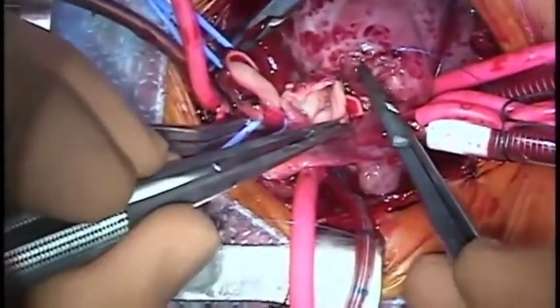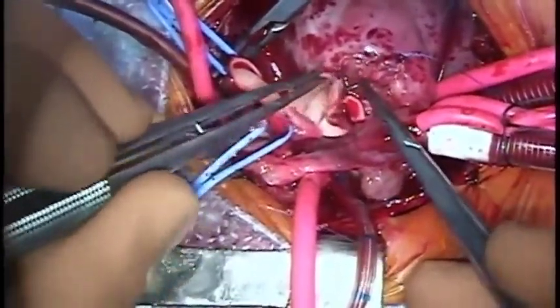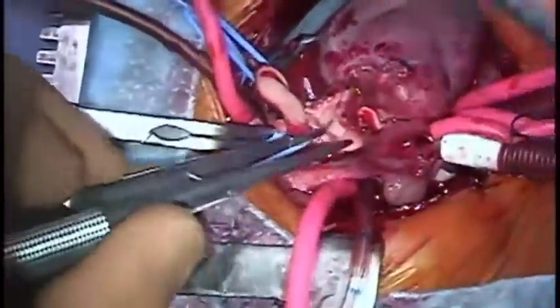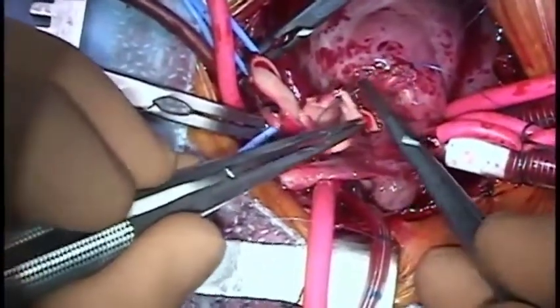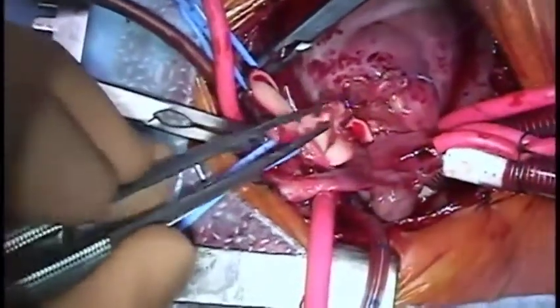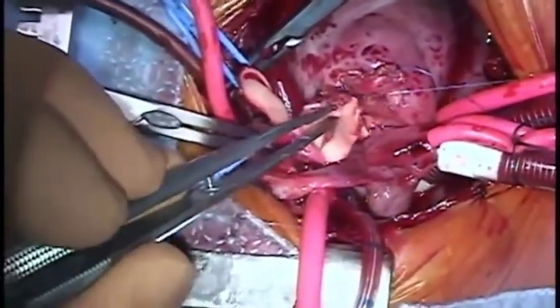The anterior part of the anastomosis is now constructed. Here the sinus is fashioned by spacing sutures further apart on the aorta than the coronary in order to use the material from the inside of the L-shaped flap to create the sinus. Once the coronary ostium is passed, the button can be trimmed off obliquely, aiming towards the end of the last suture line.